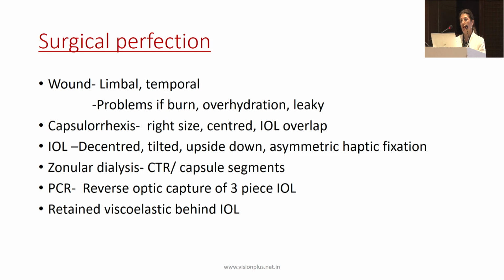But sometimes if you have very hard cataracts, you have a burn, you have overhydration also is a problem, or you have a leaky wound. Rhexis has already been spoken about, and IOL centration has also been spoken about. Sometimes in small pupils, you may have an asymmetric haptic fixation. So always check that your haptics are both in the bag.